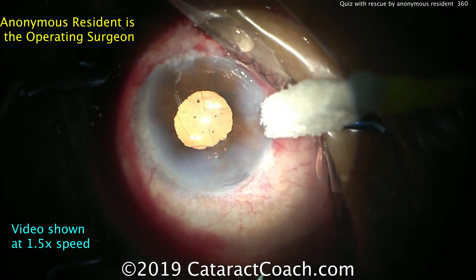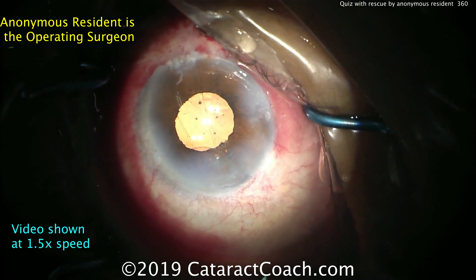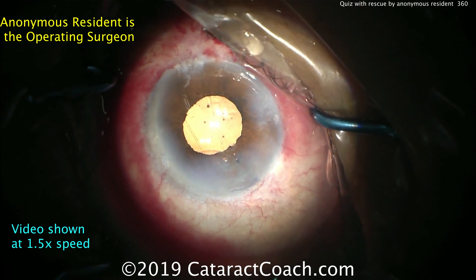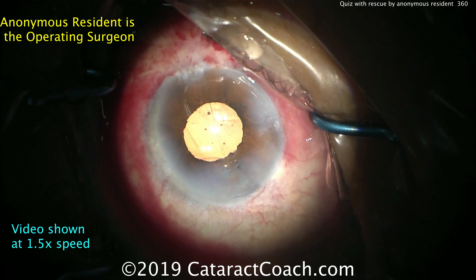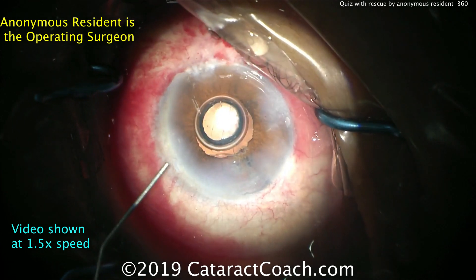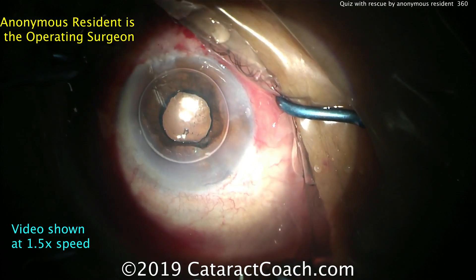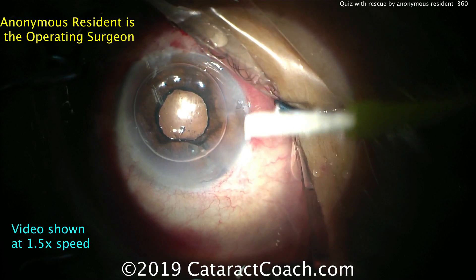The surgeon is going to use a sponge to check the incision and make sure it's all sealed up. And though it's not really popular in America, in some countries we like to put an air bubble inside the anterior chamber at the end of these complicated cases — sometimes even at the end of routine cases. Here's an air bubble of filtered room air going in. The air bubble confirms there is no vitreous prolapse. The pupil looks nice and round.